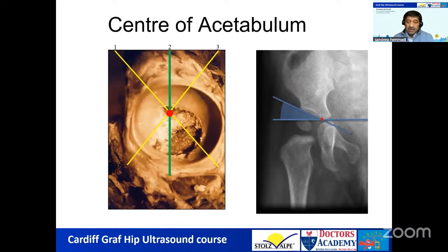So to make it reproducible, we have to get our scan through the center of this acetabulum. The center of the acetabulum we know is where, if you saw the anatomical picture, the Y-shaped triradiate cartilage is visible. This is the lowermost point of the ilium, and we are going to use that as one point in that standard plane. For a plane, you need to have 3 points in 3 dimensions. So we'll start with this one. We must see this lower limb in our scan, and that becomes our first point.